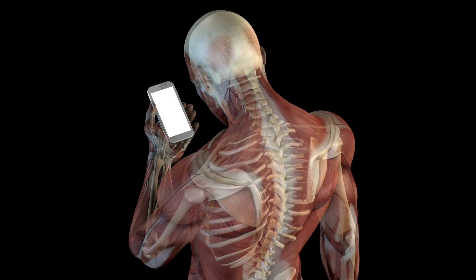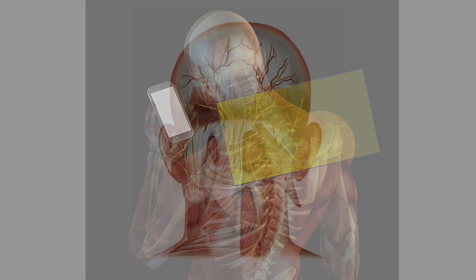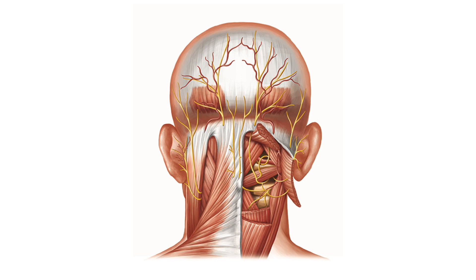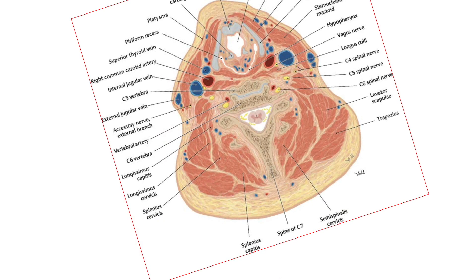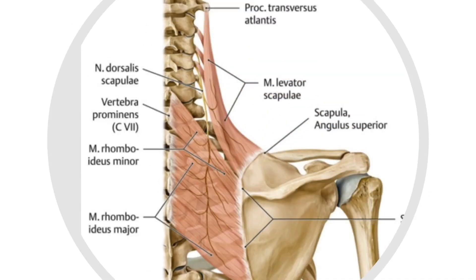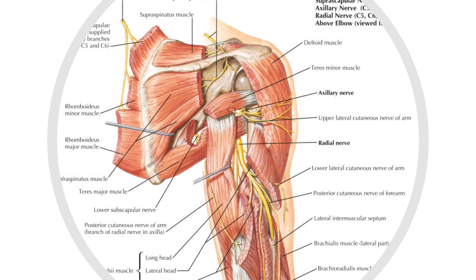When you do an ultrasound scan of the posterior neck and interscapular region, we must study each muscle group in advance and know the orientation of multiple layers before scanning. Even though we believe we know the muscle, it is not easy to differentiate each layer on the ultrasound scan because it shows cross-sectional anatomy. Furthermore, the dorsal scapular nerve is too tiny and deeply located in the posterior neck region, so it is impossible to detect the nerve on sonogram. However, it is possible to block the nerve under ultrasound guidance because the dorsal scapular nerve consistently passes in the interfascial layer under the leviator scapular muscle and rhomboid muscle group.